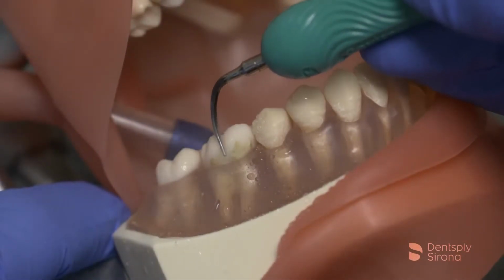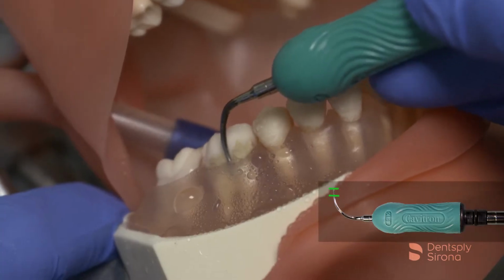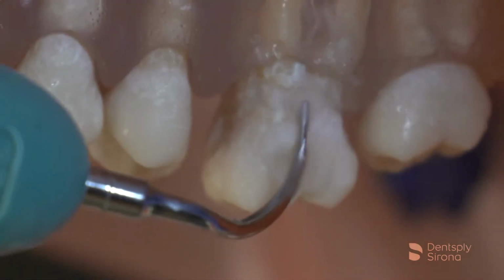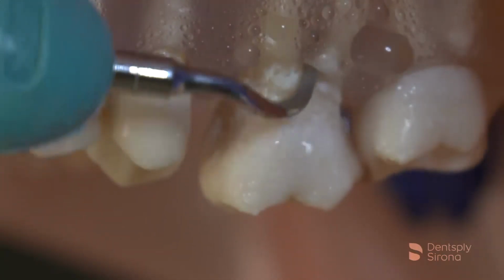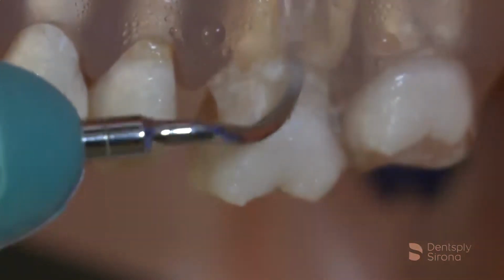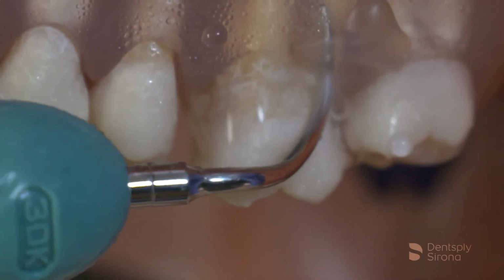Begin on the clinical crown, float subgingivally, riding the anatomy and clinging to the pellicle while always maintaining 2 to 3 millimeters of adaptation and no more than 15 degrees angulation. Navigating the pocket, assess while entering and engage any deposit encountered with a gentle tap. Frequent, methodical, overlapping strokes are essential in the periodontal pocket to detoxify and debride every square millimeter. A haphazard approach will leave deposit and biofilm behind and limit the patient's response to therapy.